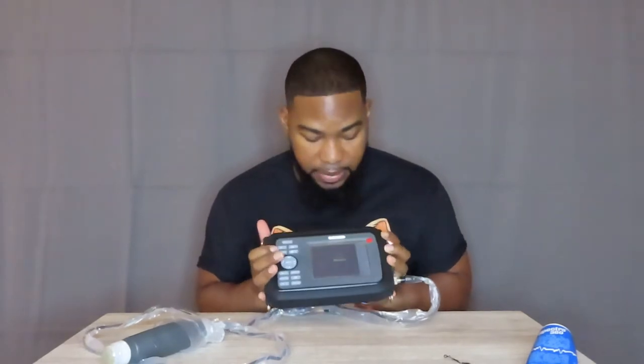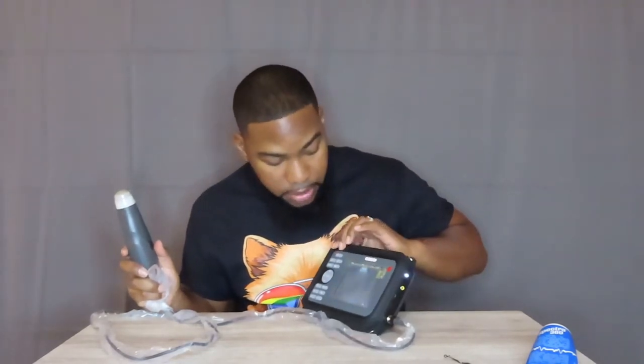I'm gonna go ahead and cut it on. I still have the plastic on it. I don't intend to take it off. You're gonna get a welcome screen once you turn it on. Then from that welcome screen, you can either start it by pressing the button on the probe, or you can press the freeze button on the actual machine, or any button for that matter. And then it comes on.